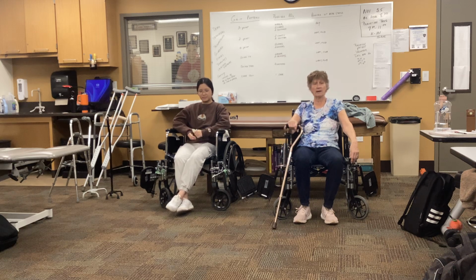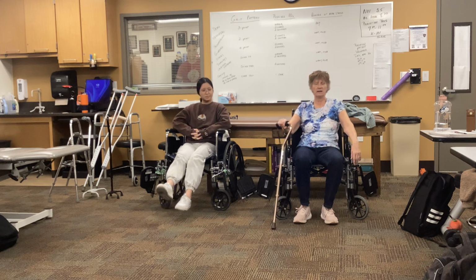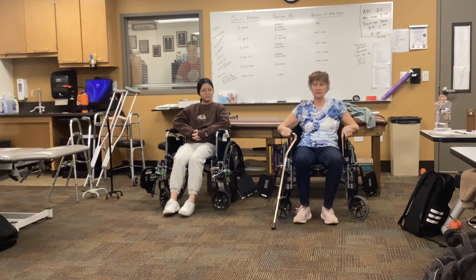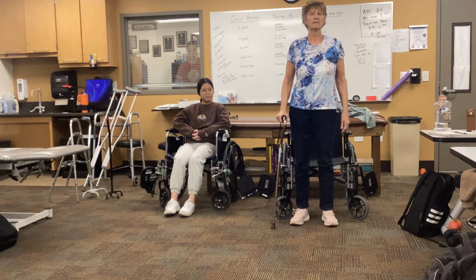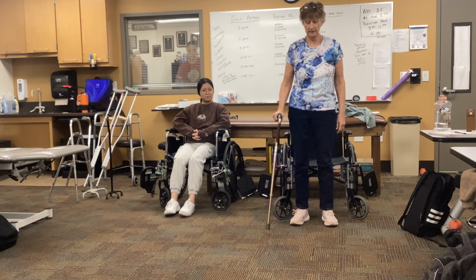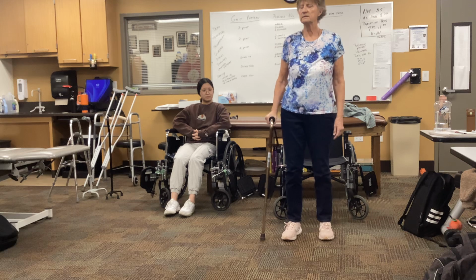Let's find out why. My left leg is my sore leg, my involved leg, my painful leg, the one I've progressed from a walker, from my surgery. So the cane is going to go on my right side. Now, the very lowest level, what could be called a 3-point gait, is cane, left, right.